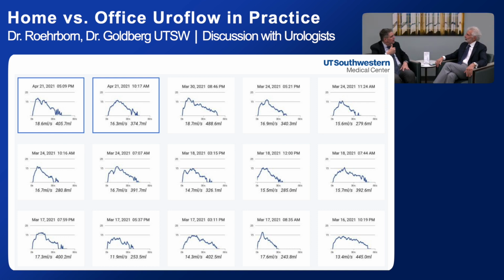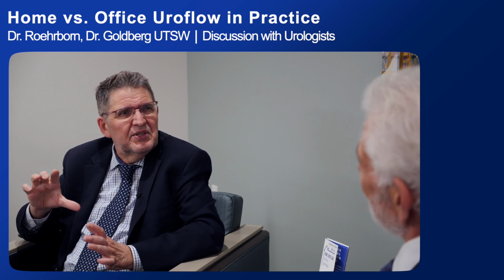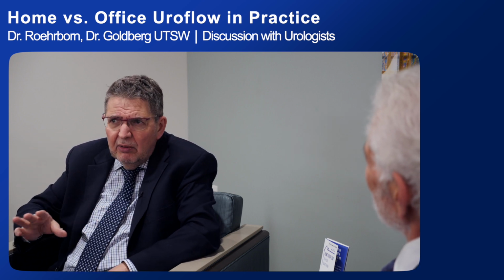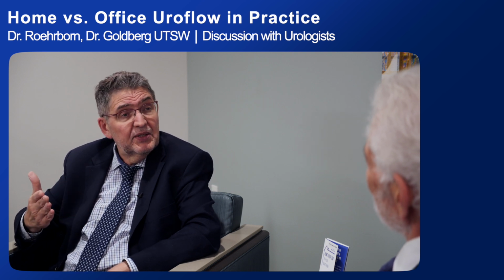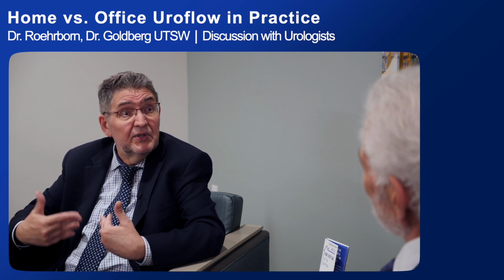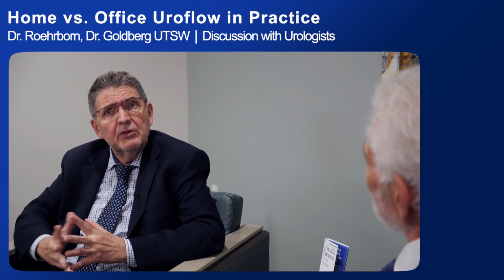This also is interesting because a patient in the office voiding a small volume may say, well, that's just today, that's just in the office. But if the patient at home, where he has all the leisure and all the access to the toilet that he wants, always voids under 100 cc's, we know that patient has OAB. For sure. He has frequency, urgency, and that's his problem, right? It may not be the prostate, but it may be that. So that's a good example.